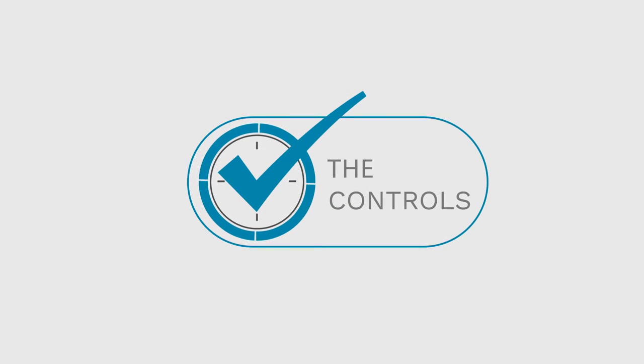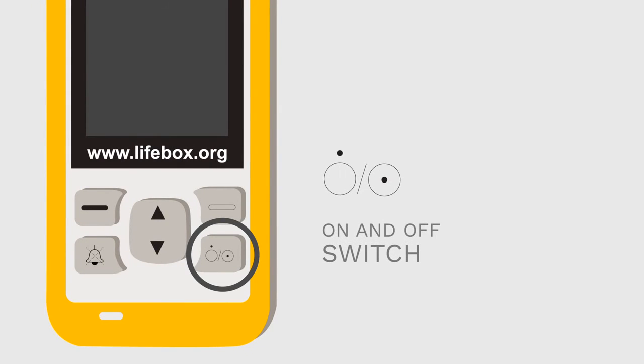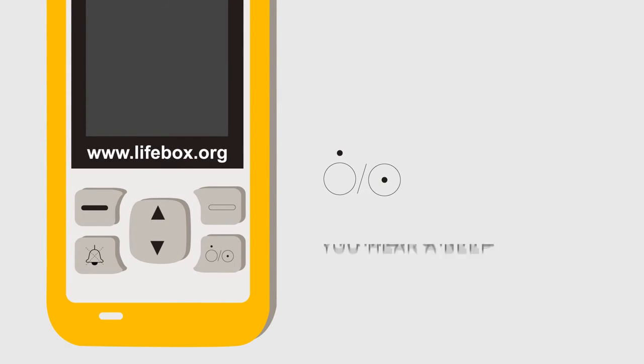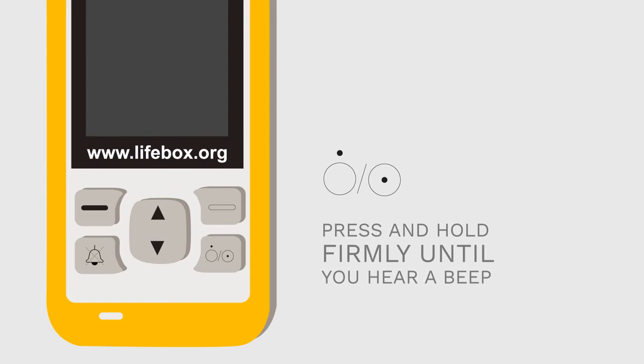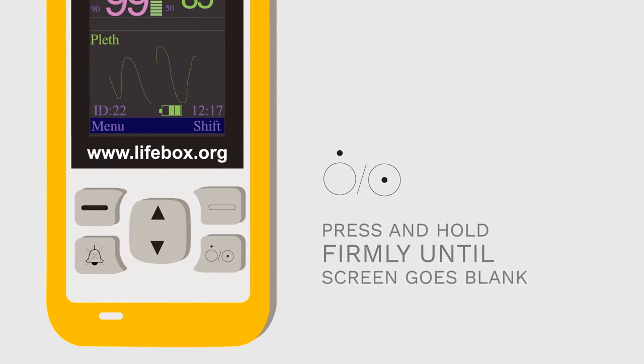So now that we know how to set up the oximeter, let's talk about the controls. The first button to recognize is this one here, which is your on and off switch. To turn on, press and hold firmly until you hear a beep. To turn off, press and hold firmly until the screen goes blank.